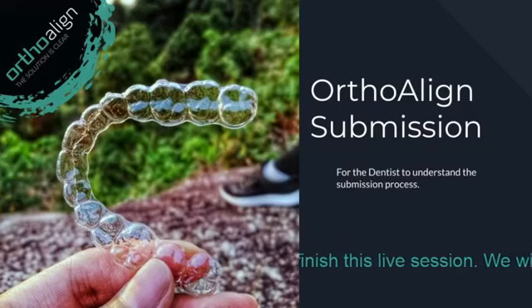So here are some examples of rejected scans, impressions, or stone models. Okay, so we can see here a void, and the cervical margin here is not clear. There's actually a void right here, so the impression material did not capture properly. So this is not going to be accepted. You definitely have to retake the impression if the stone comes out like this.